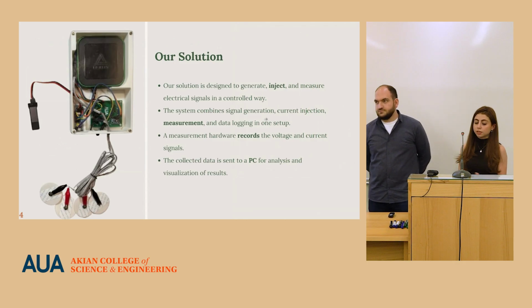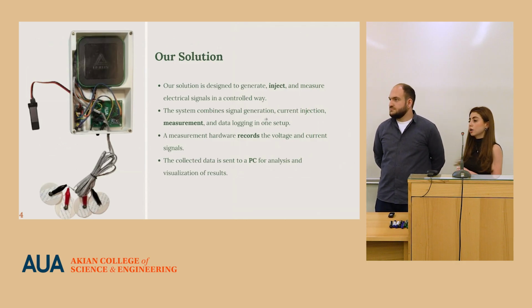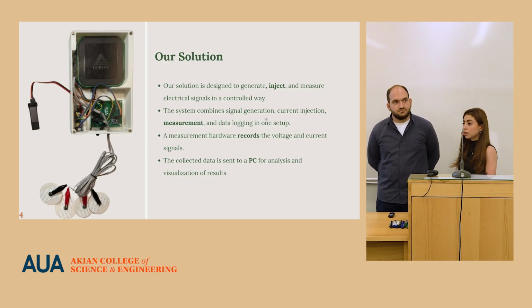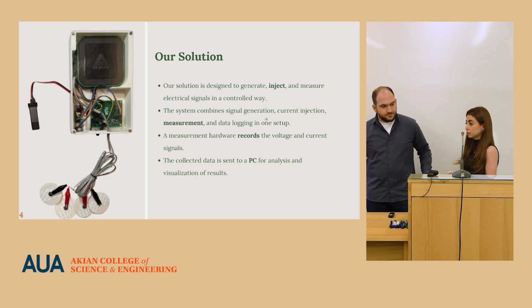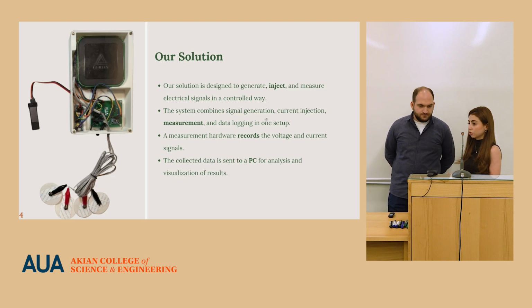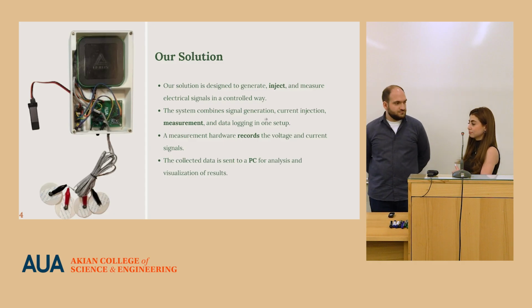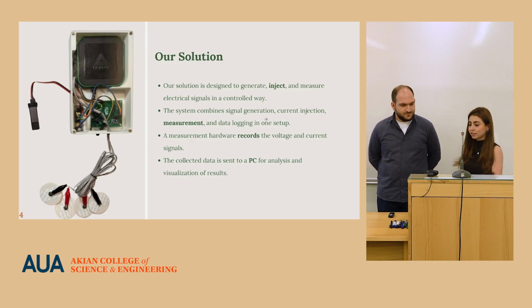Our solution was designed to generate, inject, and measure electrical signals at a high precision. It should generate electrical signals, inject the current, and also do data logging. As you can see, it is a cohesive unit that integrates all of these components.